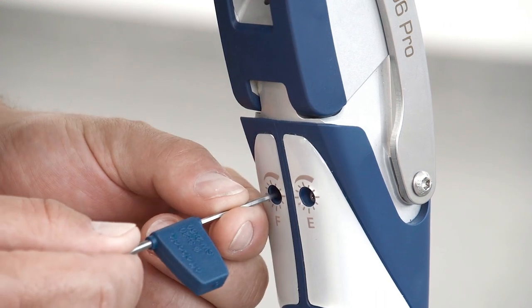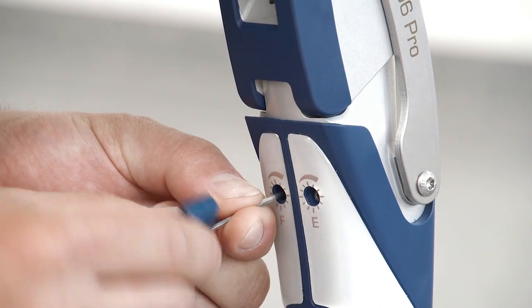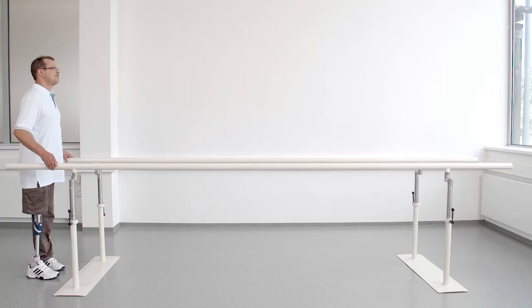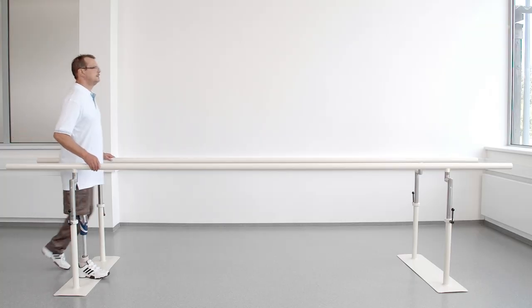At this point, the flexion damping is shown at its minimum. At higher walking speeds, the user has to wait too long for the prosthesis to reach full extension at heel strike.